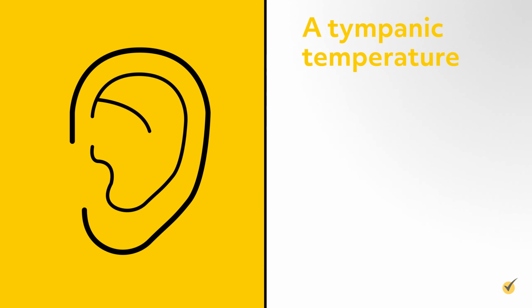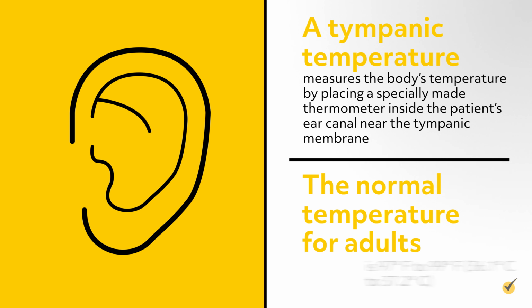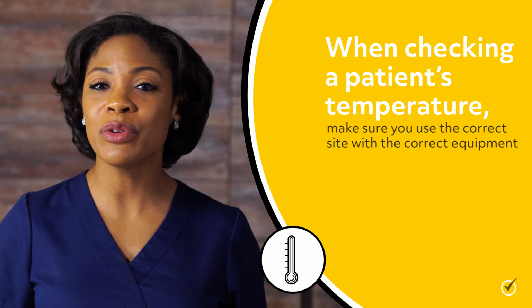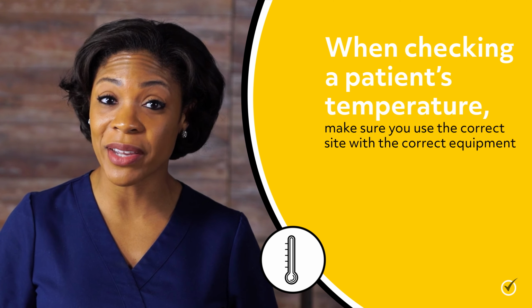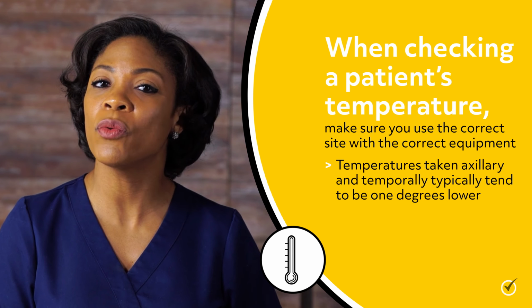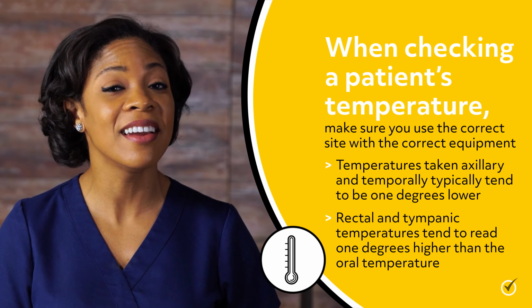A tympanic temperature measures the body's temperature by placing a specifically made thermometer inside the patient's ear canal near the tympanic membrane. The normal temperature for adults is 97 degrees Fahrenheit to 99 degrees Fahrenheit, which is 36.1 to 37.2 degrees Celsius. Remember, when checking a patient's temperature, make sure you use the correct site with the correct equipment. Also, temperatures taken axillary and temporally typically tend to be 1 degree lower, and rectal and tympanic temperatures tend to read 1 degree higher than oral temperature.